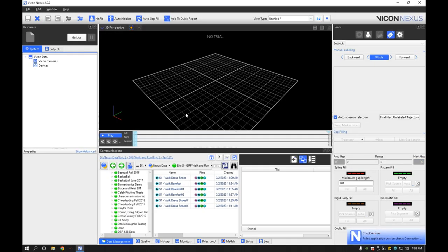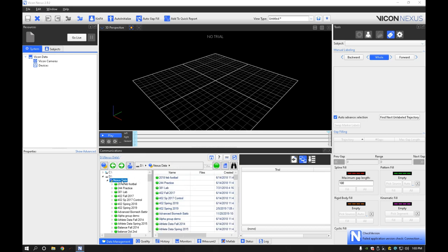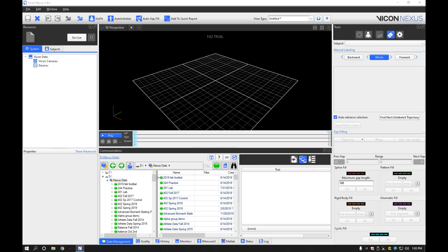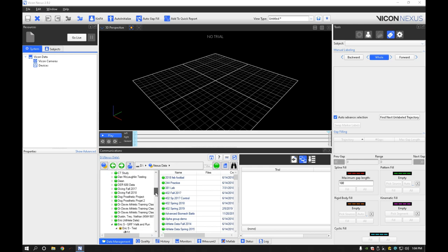Alright, great. So before we can get started with anything, we're going to come over to this Nexus data and we're going to create something for the semester here.